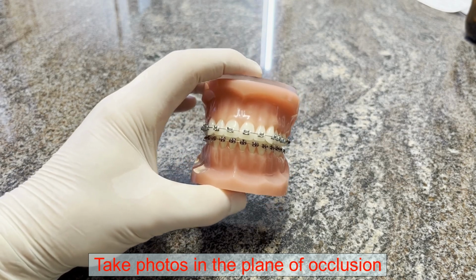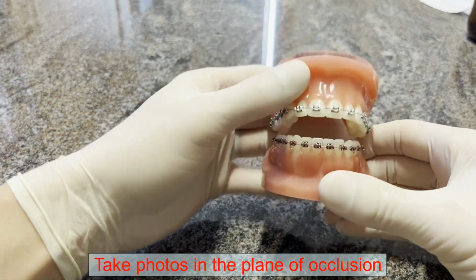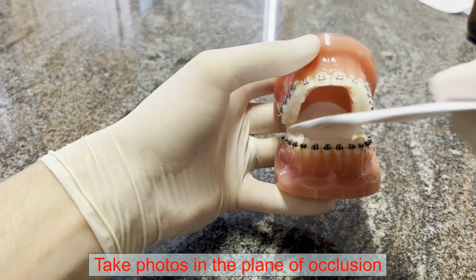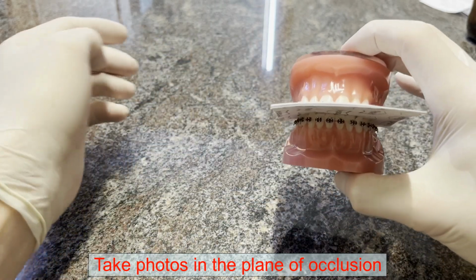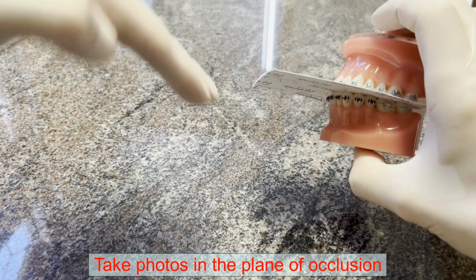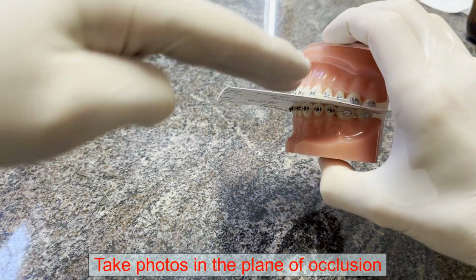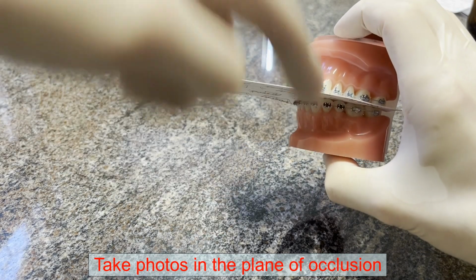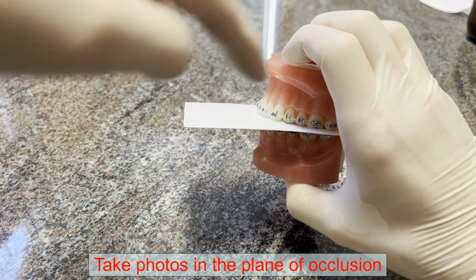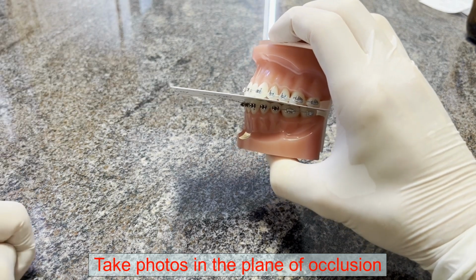So every photo should be taken with the flat plane of occlusion. The plane of occlusion is the surface that, if you were to bite on a card like this, is the plane of occlusion. Like that plane that is on all the biting surfaces of the teeth. So when you're taking the side shot, you want the occlusal of this side to line up with the occlusal of that side. So not like this, like you're taking it from up above, or like this, like you're taking it from underneath. You want it nice and lined up, just like that.